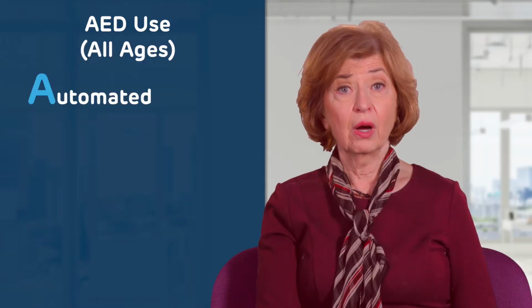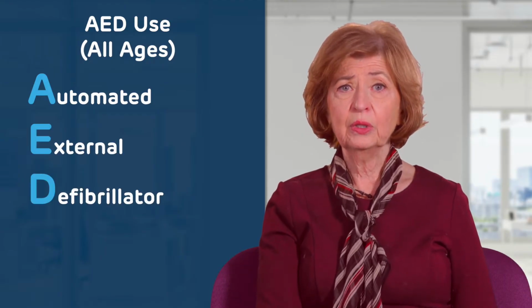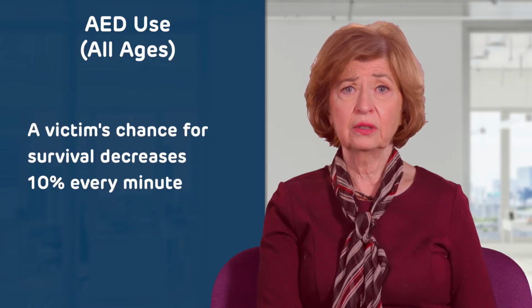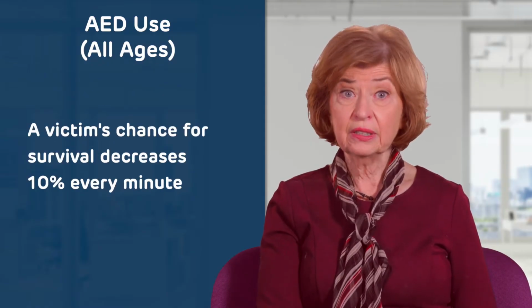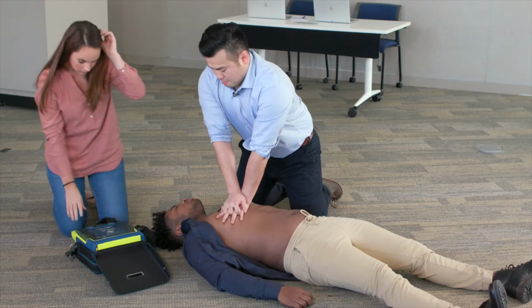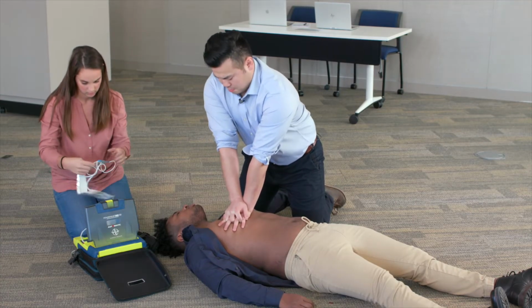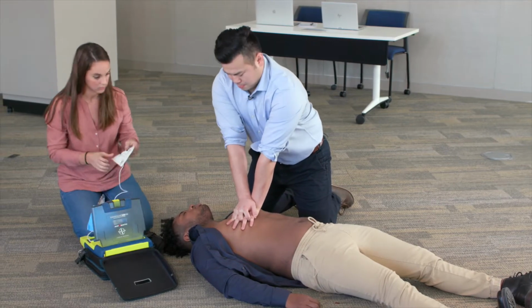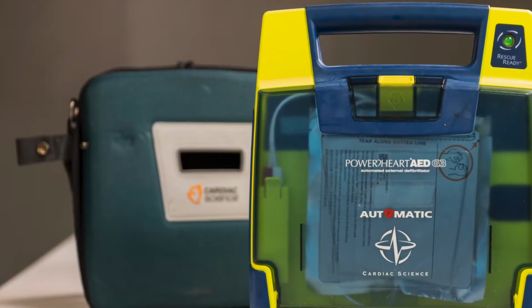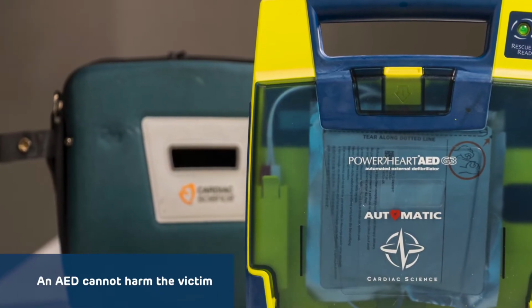AED stands for Automated External Defibrillator. It is important to know how to use an AED because a victim's chance of survival decreases by 10% every minute after a sudden cardiac arrest. You can help save a life by retrieving and using an AED before EMS arrives. Anyone can use an AED. It's quite easy to use and cannot harm the victim.